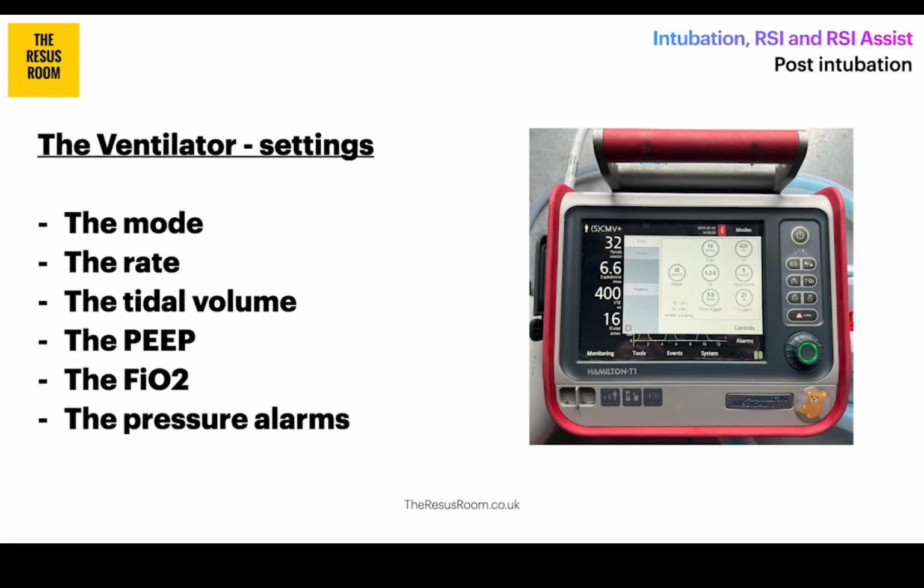And that exact amount will be determined by their injuries or illness and their comorbidities, but will generally be somewhere between 94 to 98% on your peripheral oxygen saturations.